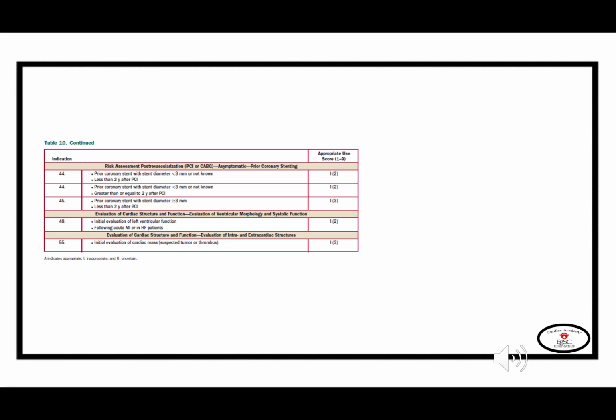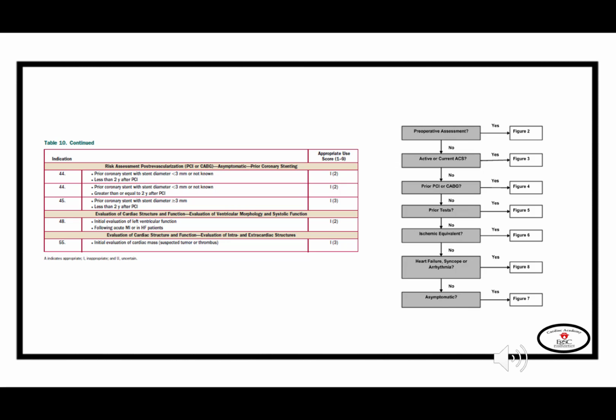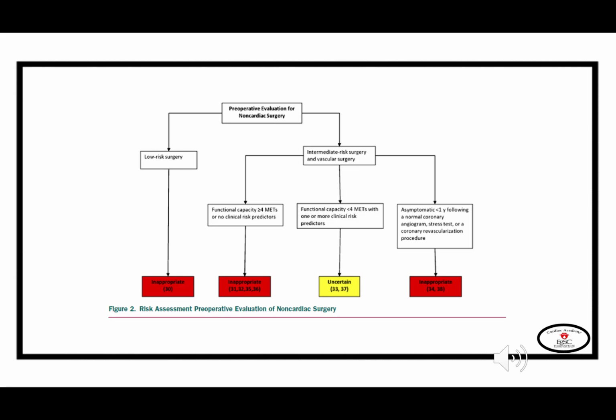There are also inappropriate indications, as we can see here, and they created different algorithms for different clinical scenarios in which we can determine in which clinical scenario it is appropriate to use the coronary CT angiogram.